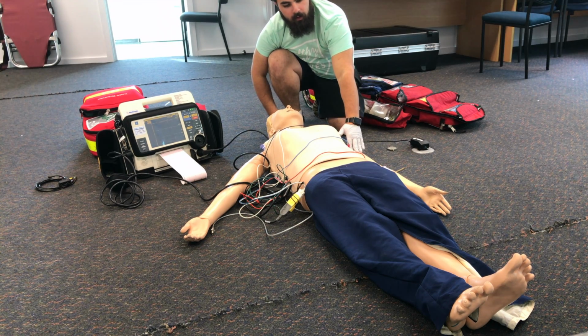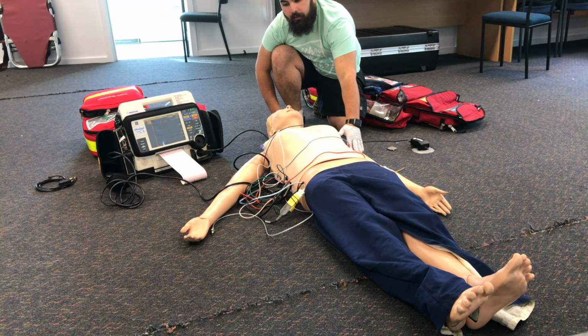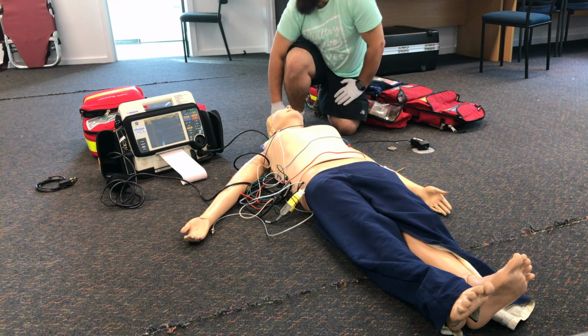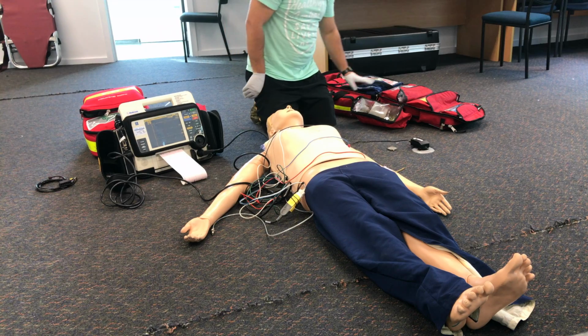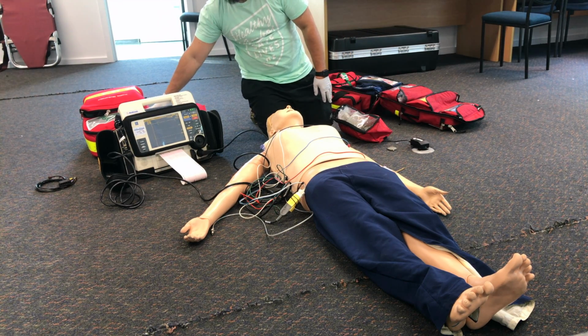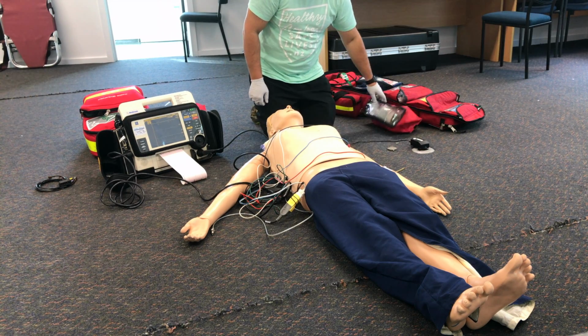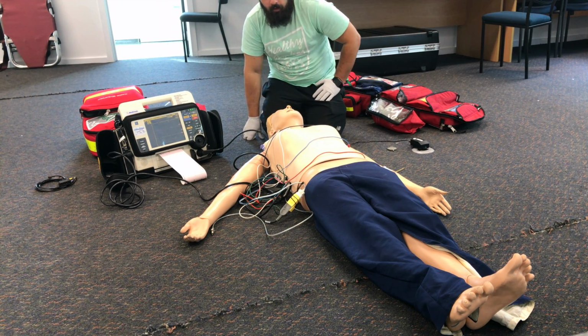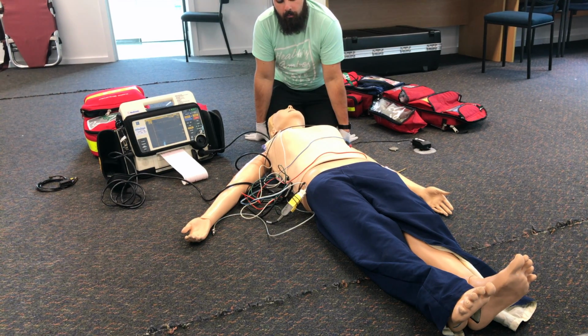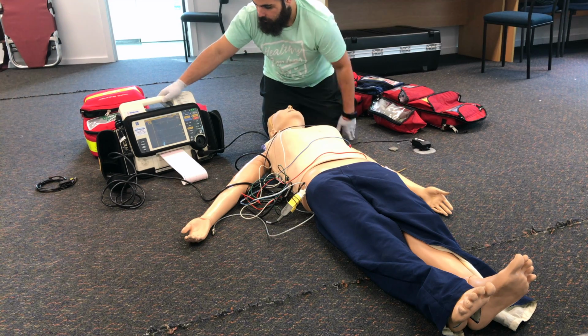So I've prepared an IV site, a large bore IV in the left ACF. I'm going to prepare some of my resusc equipment, so I've got my ventilation bag, oxygen, advanced airway kit as well. I've attached the pads, and I'm going to prepare for pacing. Now that everything's set and ready to go, we're going to begin the pacing sequence.